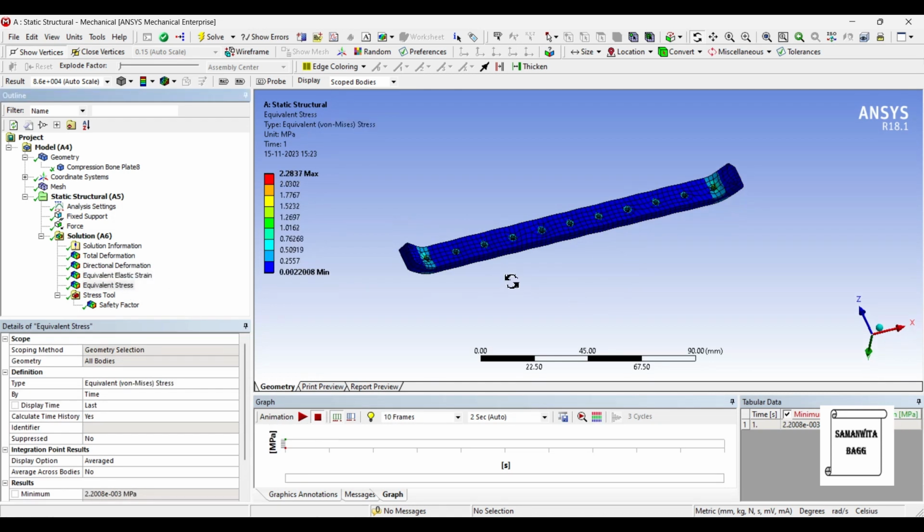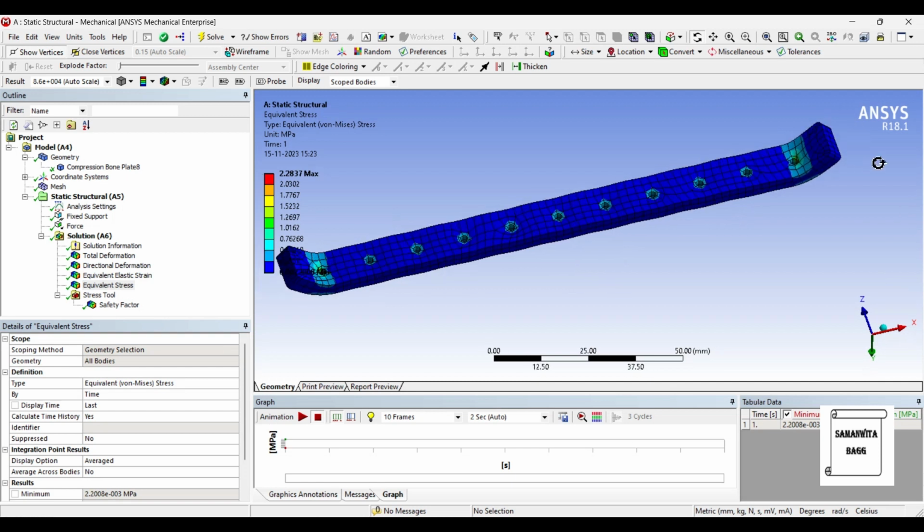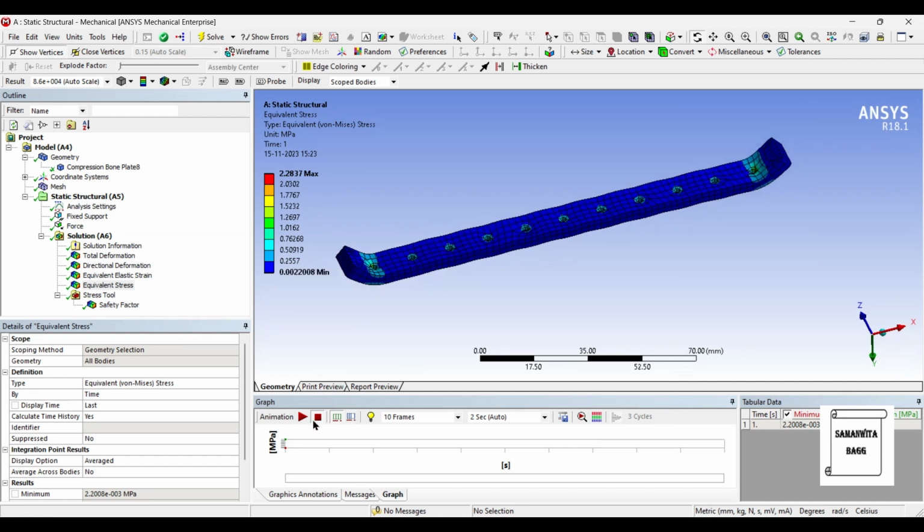Next, we'll see the equivalent stress first. You can see here, the zone is where the stress is maximum, and on the holes is where it is more. The maximum value of stress is 2.28 megapascal. You can animate and check this result as well. You can see these are the zones where the stress is generated.